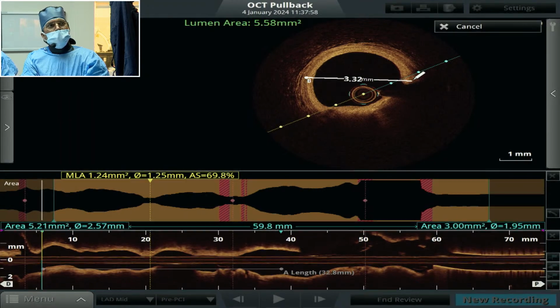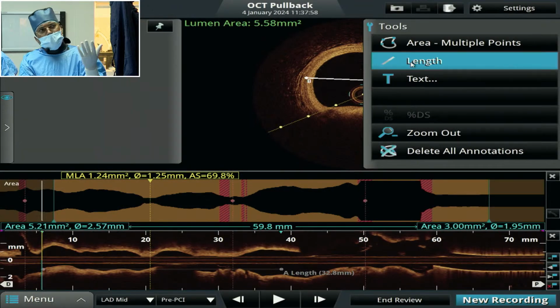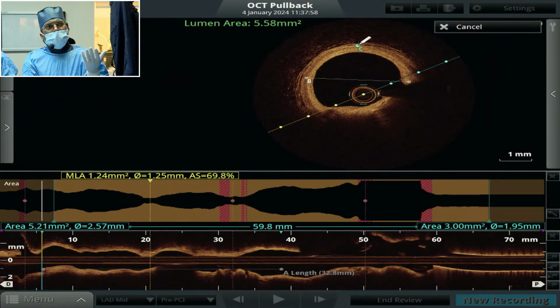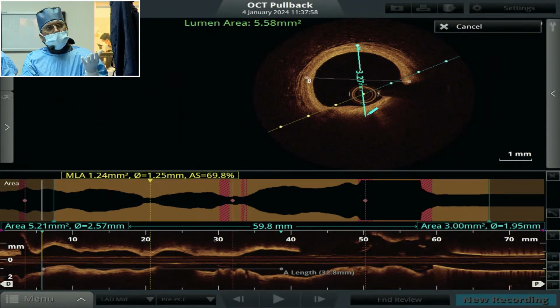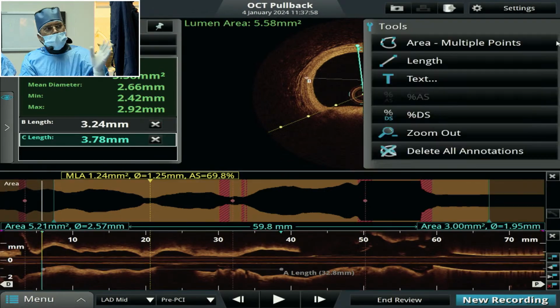So, this is the EEL diameter, slightly go away, it is almost a 3.5 vessel, vertically you come, still down, see almost average diameter is about 3.5, we will take 3.5.